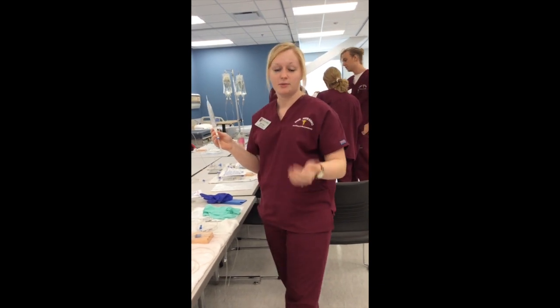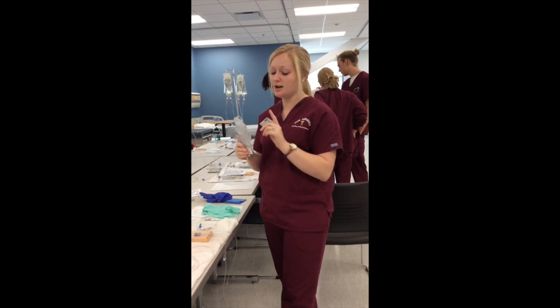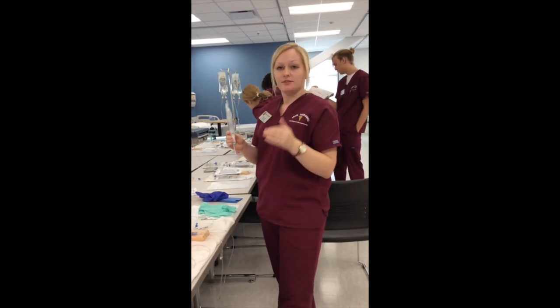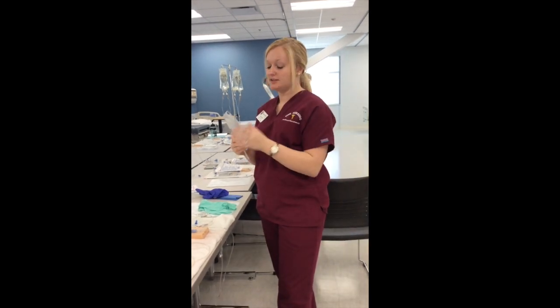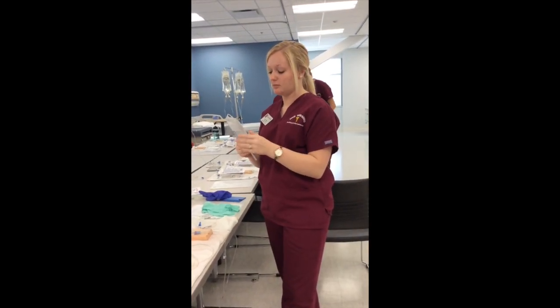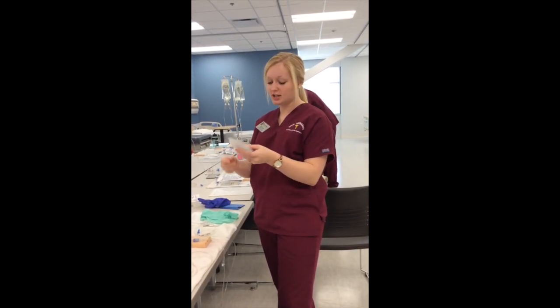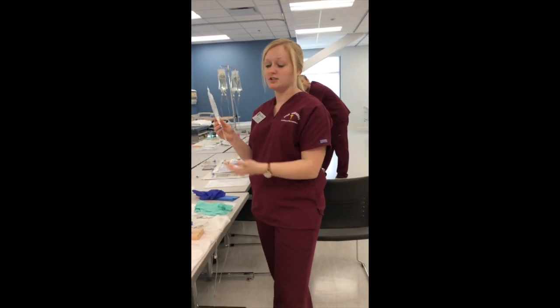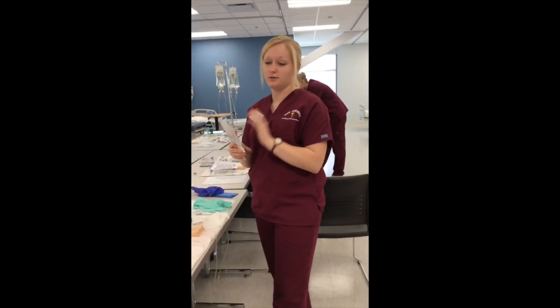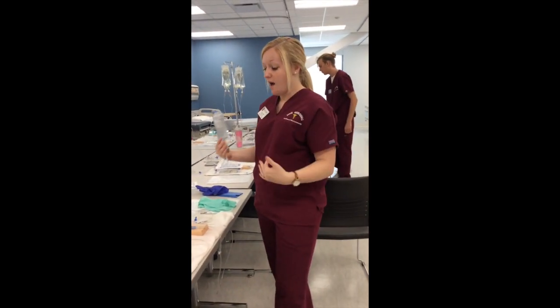I'm going to check with my medication administration book, make sure that it is compatible with the IV fluids the patient's on. I'm going to make sure that yes, it's appropriate to give it over 60 minutes, and I'm going to check things like that, make sure the concentration's good and everything. So those are the things I'm going to check. I'm also going to check on the medication, make sure it's not expired. I'm also going to check on my patient's allergies, make sure they're not allergic to the fluoroquinolones or whatnot. This is levofloxacin. So after I've done that, I'm going to gather my supplies and get ready to go into the room.